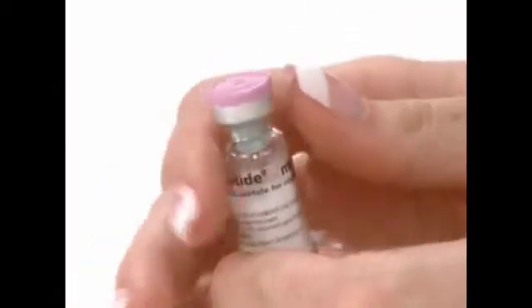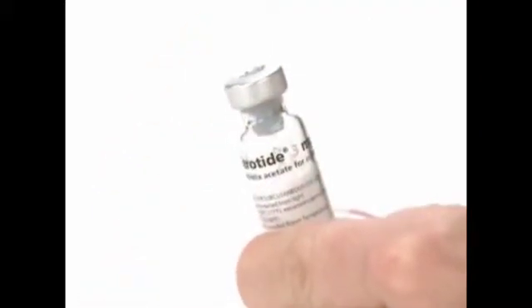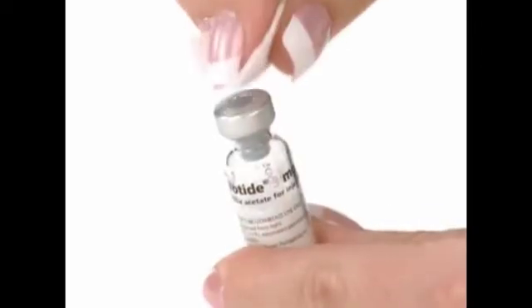Wash your hands thoroughly. Using your thumb, flip off the protective plastic cap on the Cetratide vial. Wipe the top of the vial with an alcohol swab.